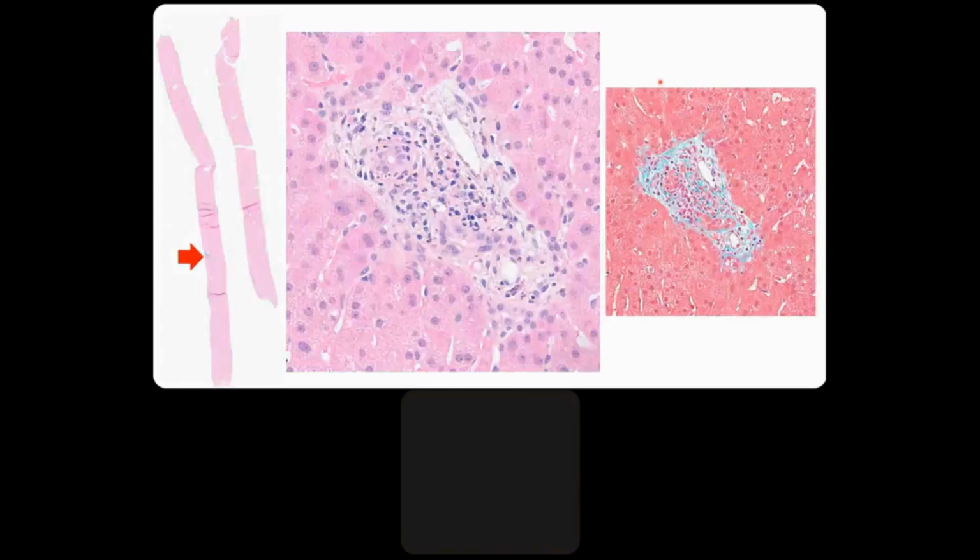The last case of biliary pathology that I wanted to present today is a middle-aged man who is post-liver transplant and presented with cholestatic liver enzymes. And because the imaging, including CT scan, were all unremarkable, a liver biopsy was performed. Here is the liver biopsy. You can see obviously that the liver biopsy is abnormal.